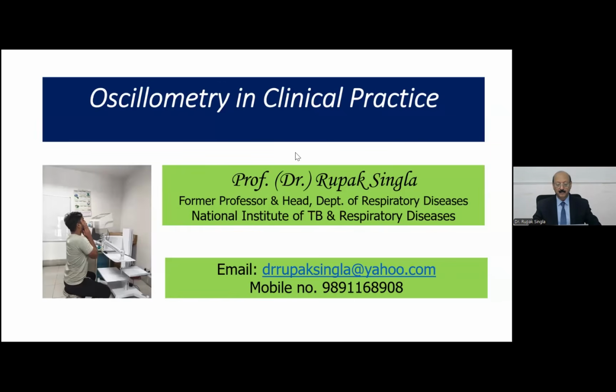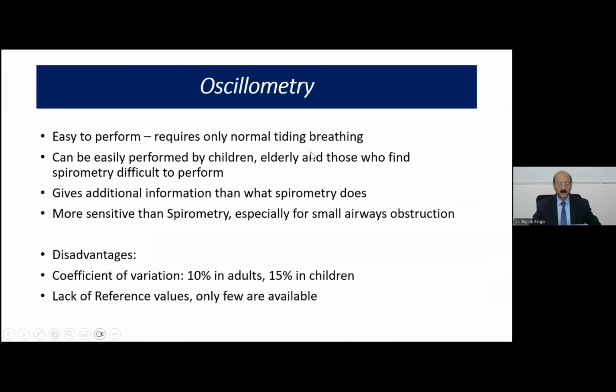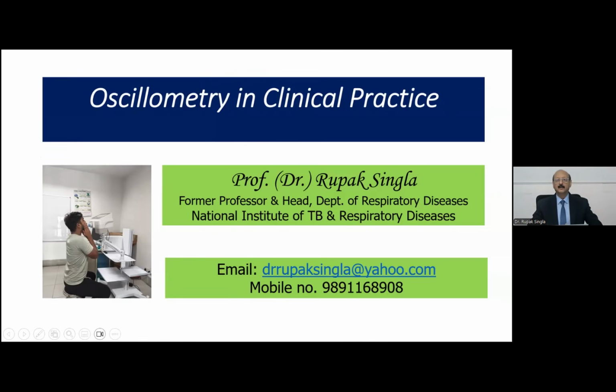In this video, I'll try to make oscillometry a very easy subject to learn, how to do it, and how to interpret it. All these aspects I'll be covering in this video. So I'll be talking about oscillometry in clinical practice.